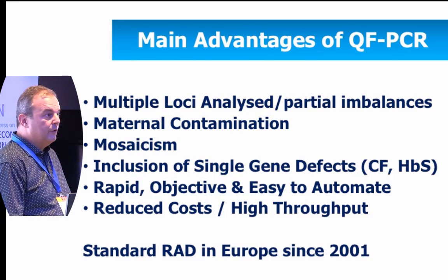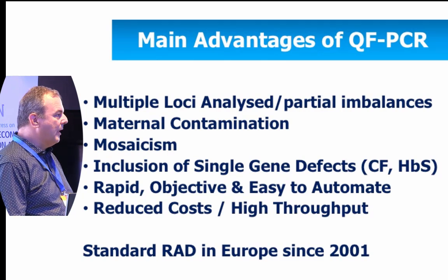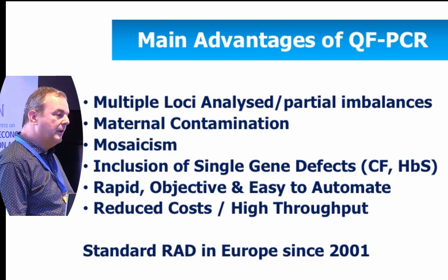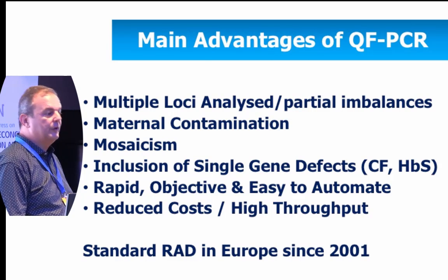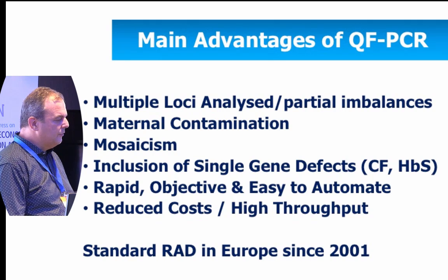Actually, in Europe, this is the ideal test to be run before any other prenatal molecular diagnostic test, even a microarray, because you have to exclude the presence of maternal contamination in any prenatal sample. And using QF-PCR, you also, of course, detect all common trisomies. It has also been shown very useful for mosaicism.